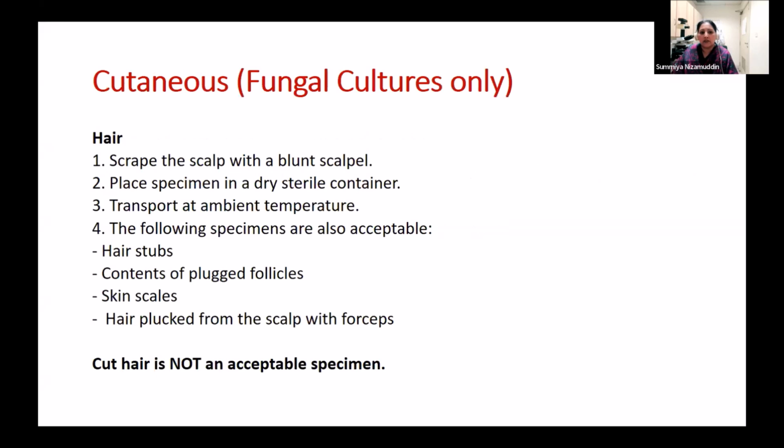right? And if you're suspecting any fungal infections, for example in someone's hair, in those cases you can send us plucked hair, hair stubs, or skin scales, and these need to be sent in a sterile container, a dry sterile container. You will not add saline or anything in it. But cut hair is not an acceptable sample, so please avoid sending that.